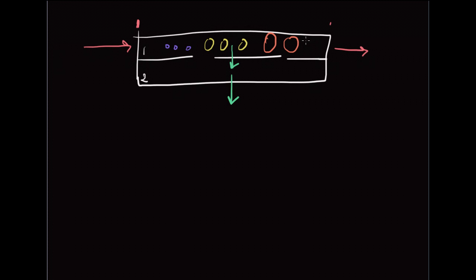Now, unlike diffusion, you don't have to depend on the intrinsic activity of these solutes, because these solutes are not moving based on their likelihood of contacting the membrane and crossing the membrane. These solutes are moving based on how much ultrafiltrate or water, the green arrow, is being shifted from one compartment to another.